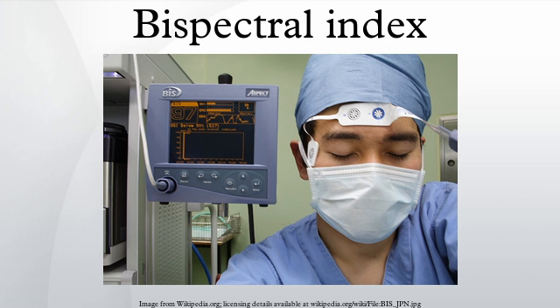The monitoring of EEG in ICU patients has been employed in one form or other for more than 2 decades. BIS monitoring is also being used during transport of critically ill patients in ambulances, helicopters and other vehicles.